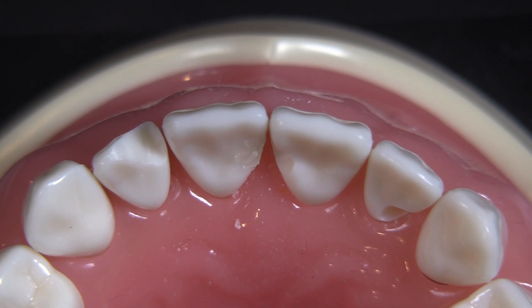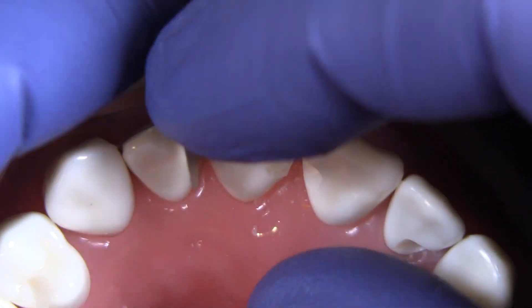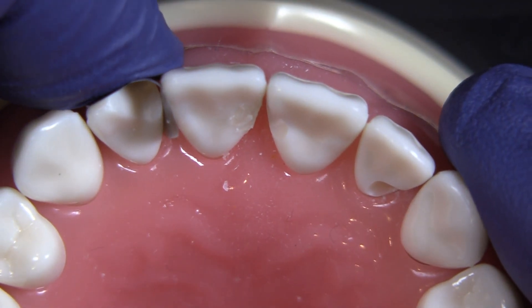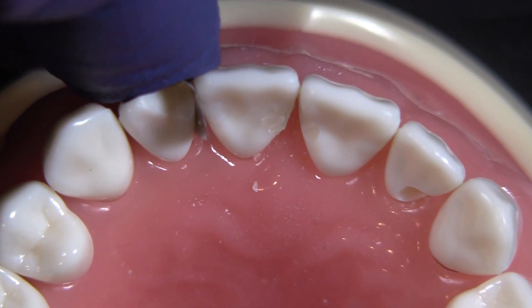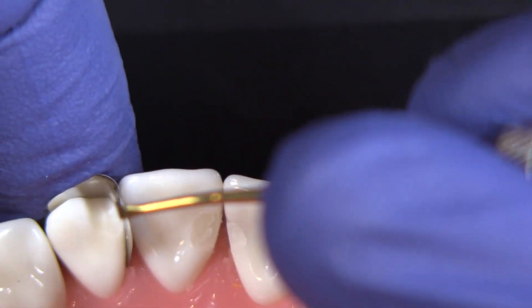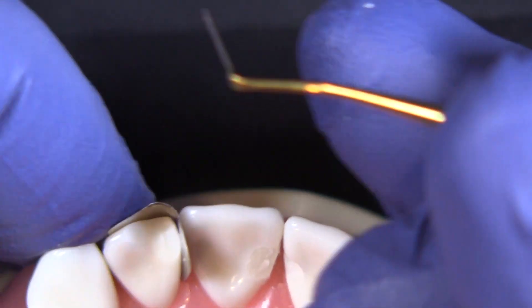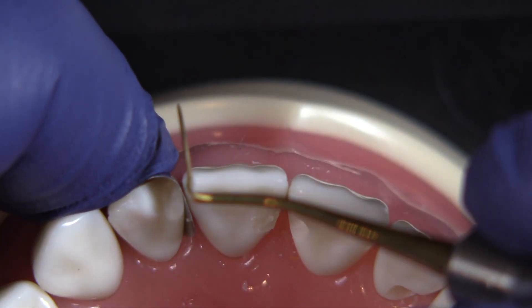What I've noticed is it's more a question of where I'm directing my finger pressure than anything else. If we're talking about this number 7 here, and this is kind of where we're going to place this band — if I put too much pressure towards the top of the band, more towards the mesial, then it might cut off that composite from being able to flow to the facial. So my pressure is going to be more over this way. Basically, I don't want to cut off the flow of that composite to the bevel.